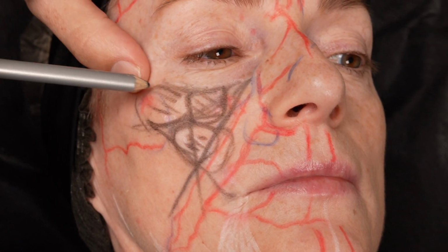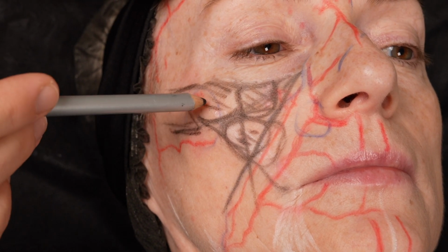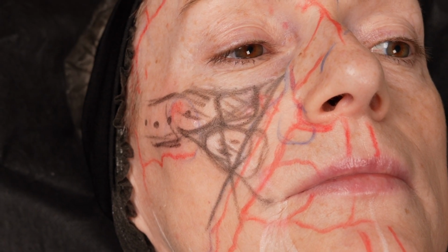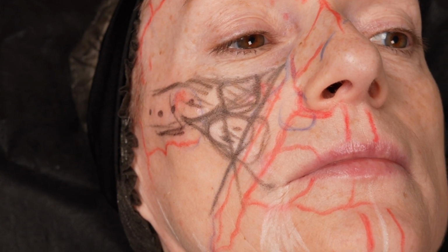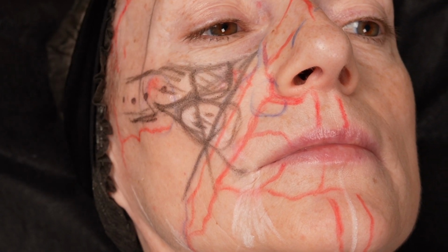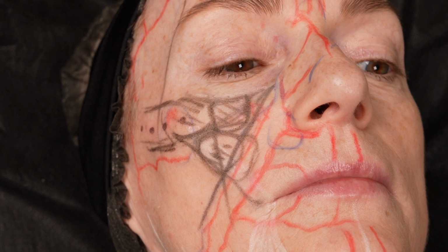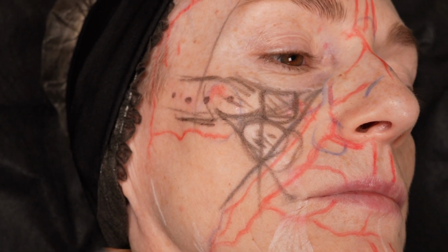But we inject also, this is like the limit of the zygoma, but I don't only inject here. For female patients, we can inject all the way in the zygoma because the lateral projection gives us a more heart-shaped appearance. And also I believe that around this limit, when you inject more laterally, it helps for a little bit of lifting effect. That's why we inject. I don't do it for the male patient usually, sometimes, but usually for the female patient to create more heart shape.